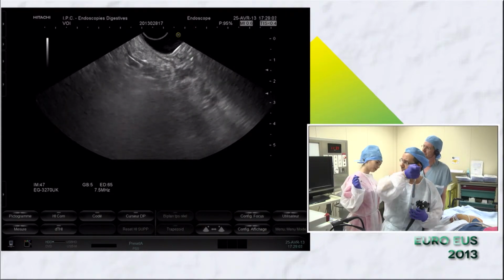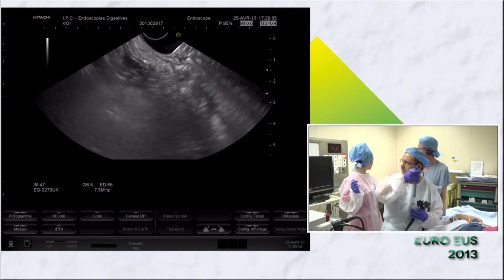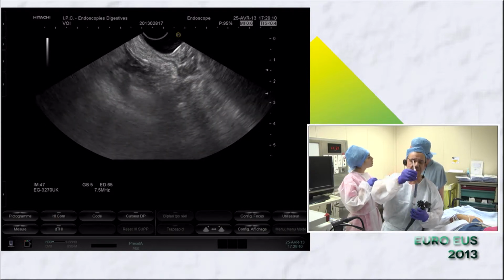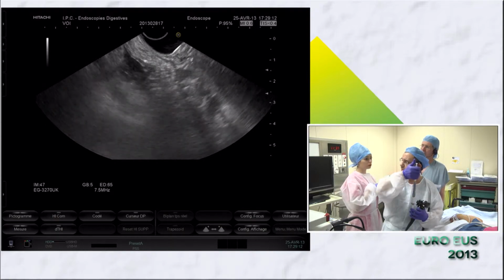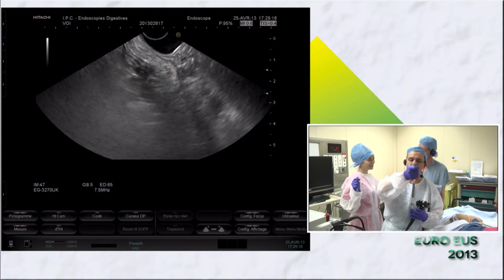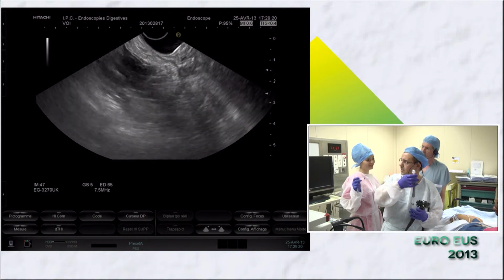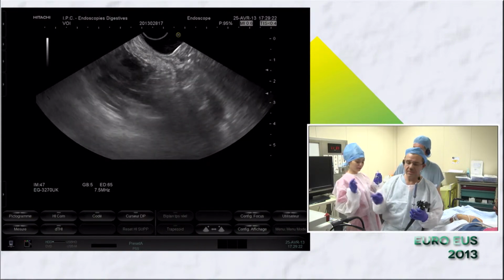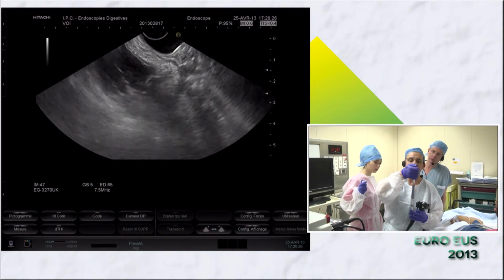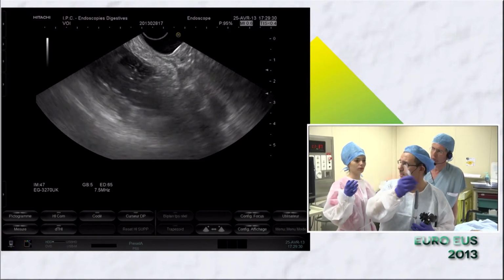Here you see the alcohol diffuse into the cystic cavity. So what was the total volume? It's 50 milliliters. So you're injecting 12 milliliters, yes. 10 now. I saw you using 95% absolute ethanol. Yes, there have been studies by Bill Brugge about the volume and the concentration.